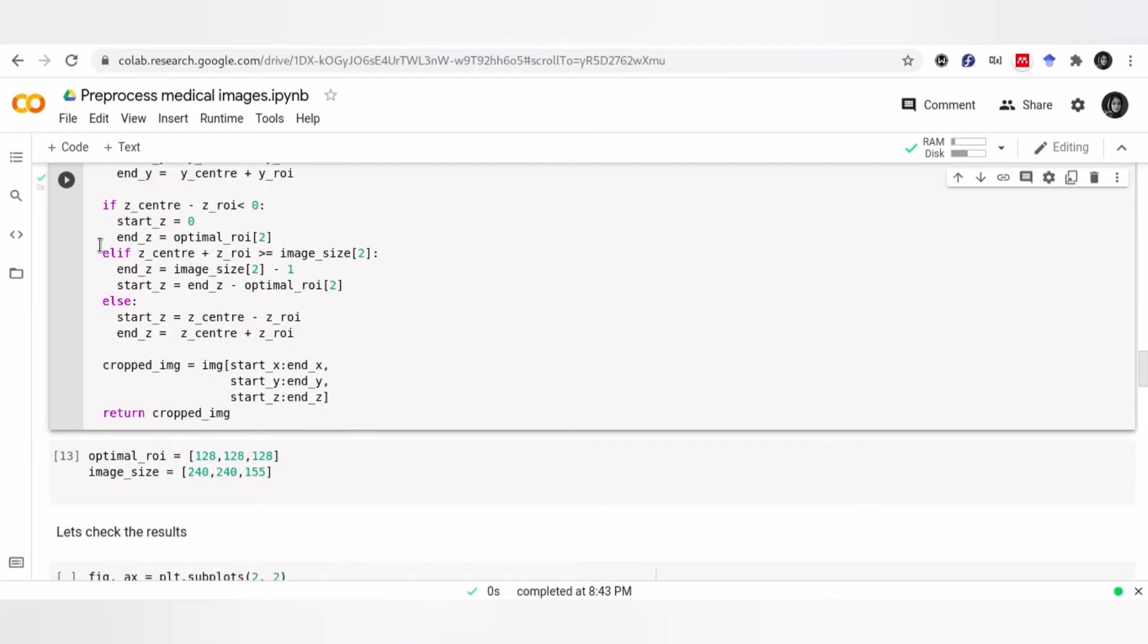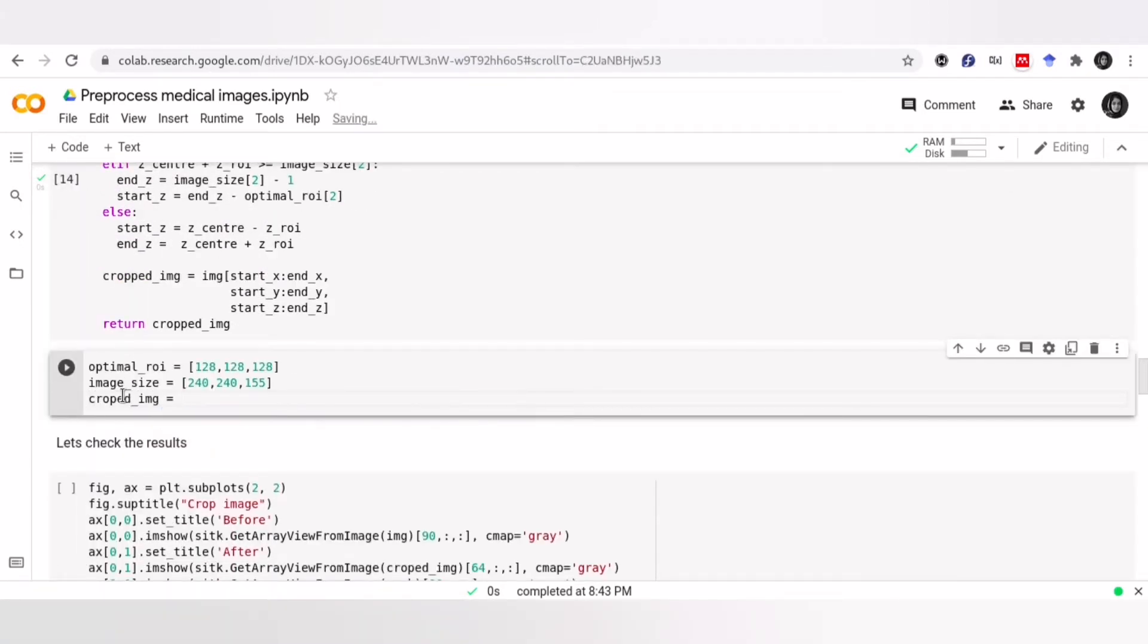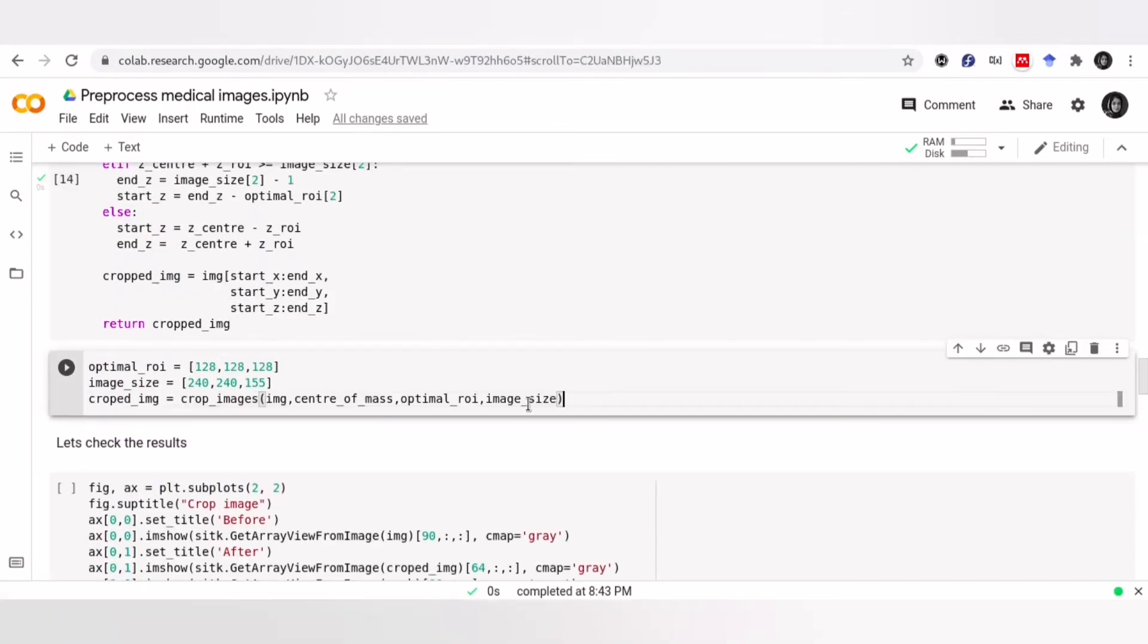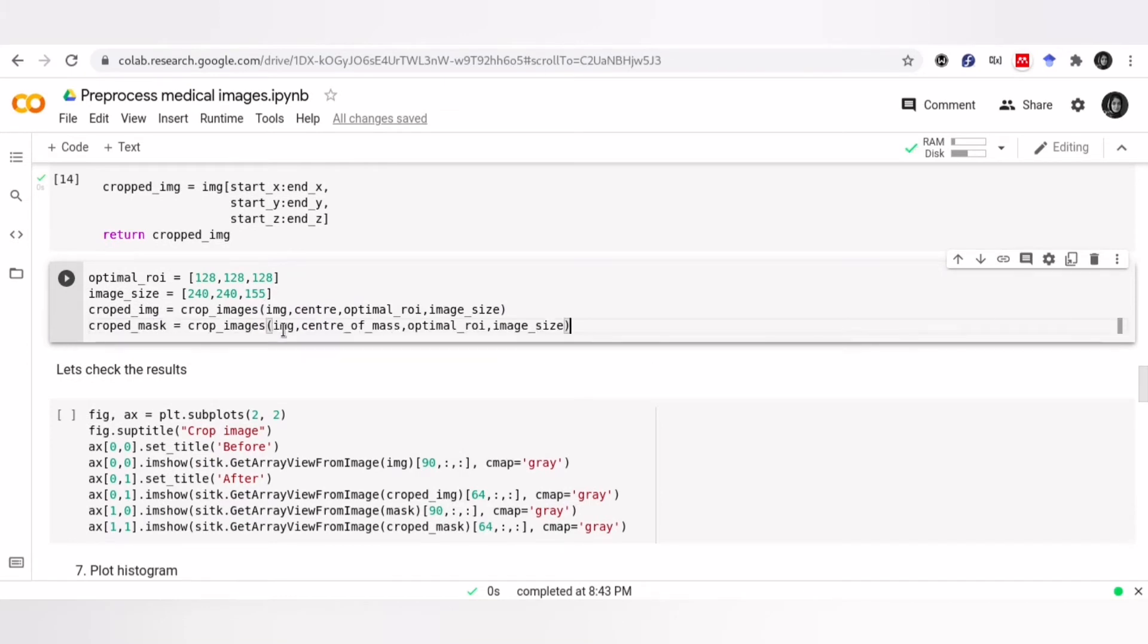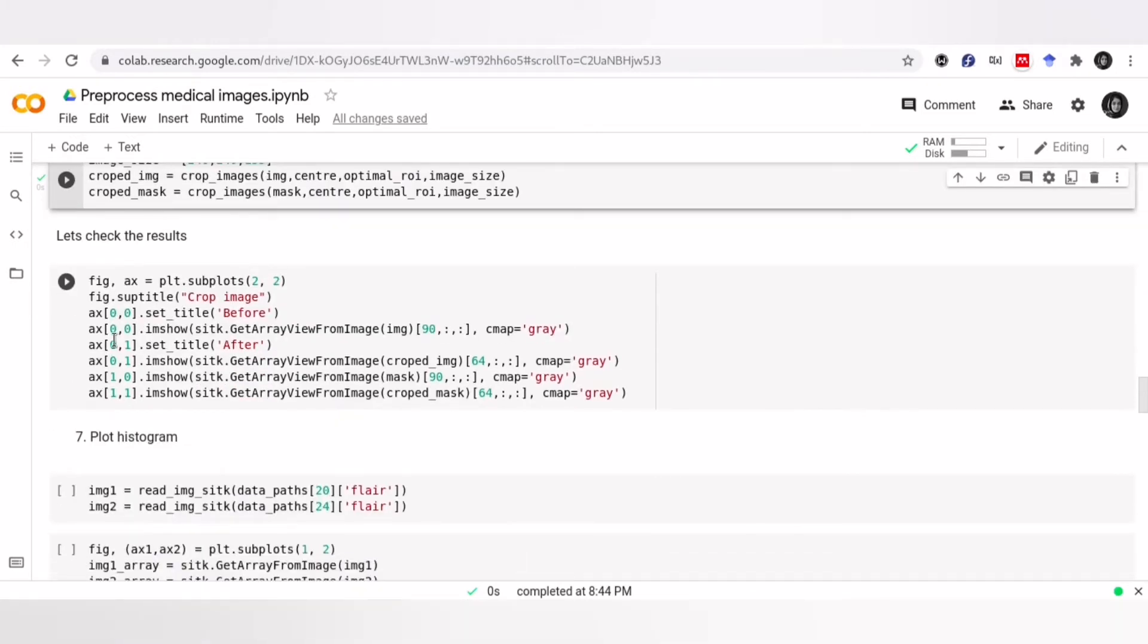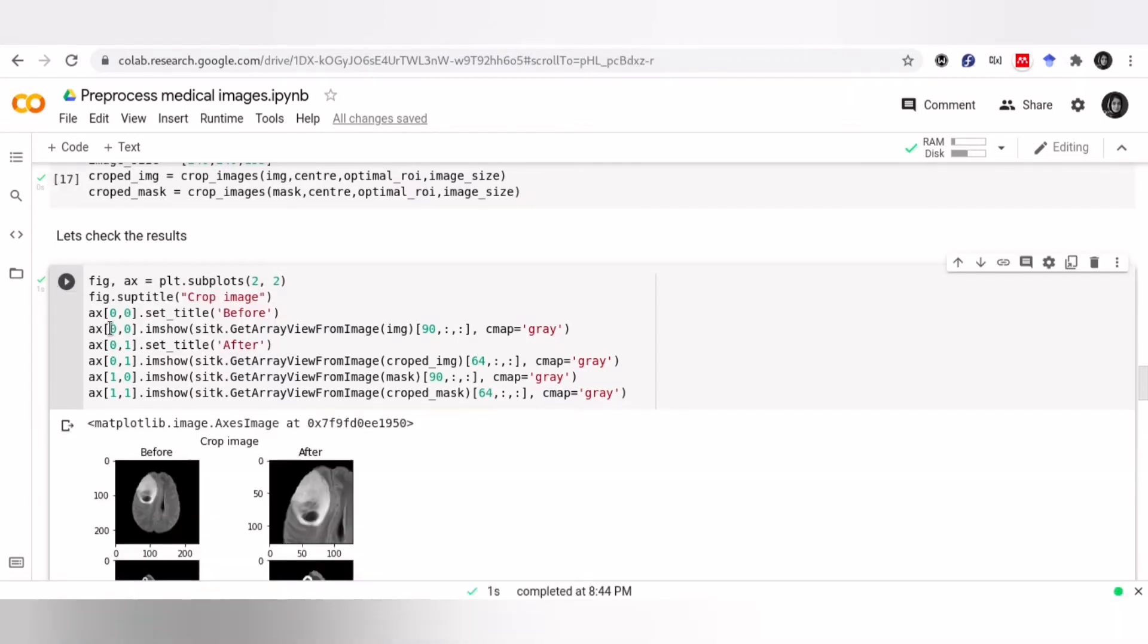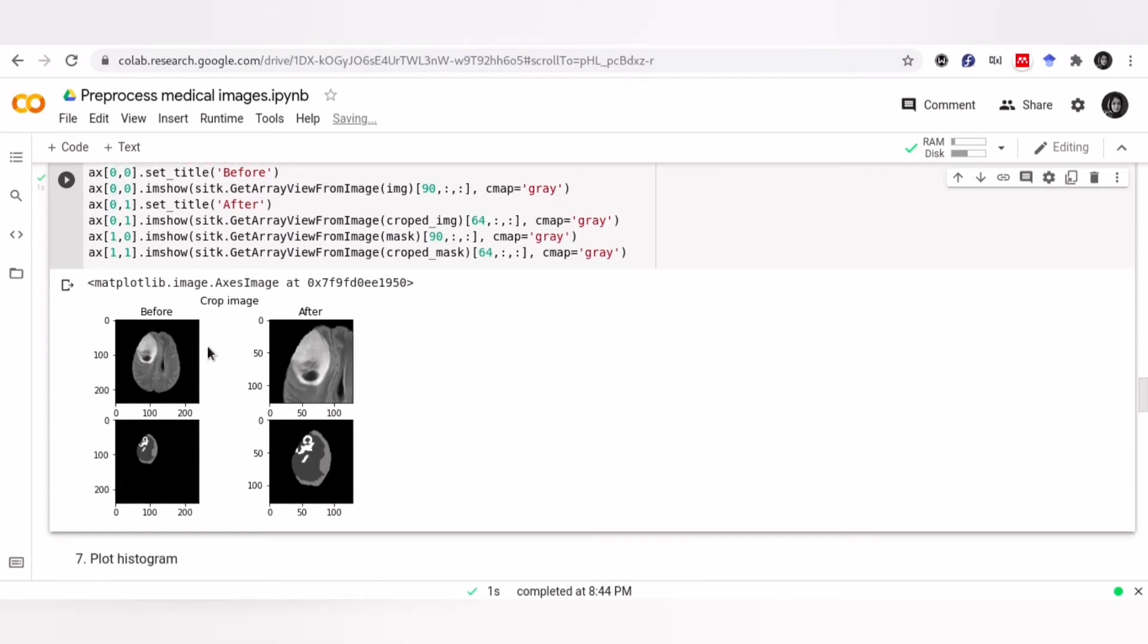Now, let's see what our function returns. Let's visualize the results to see what happened. As you can see, we have cropped our image successfully, and the tumor is at the center of our image.